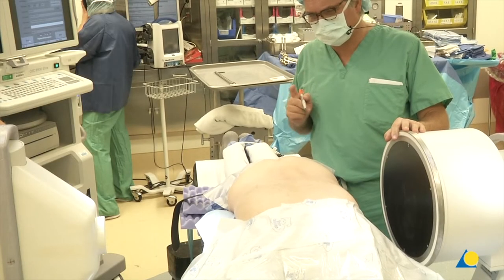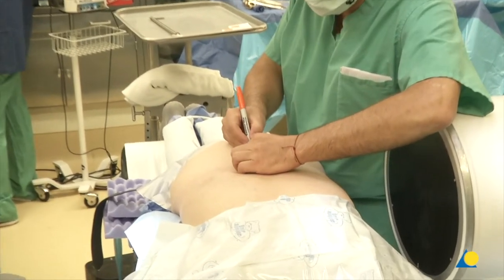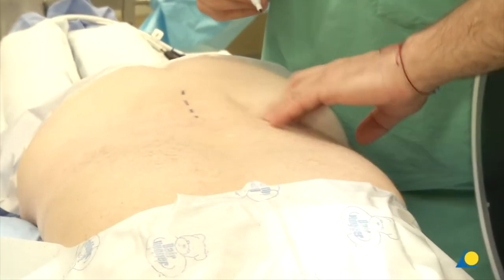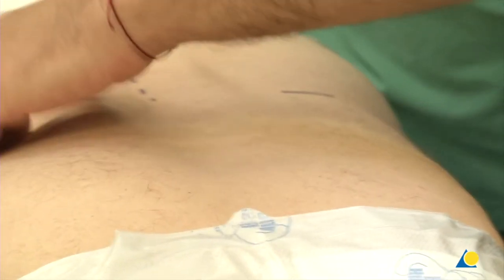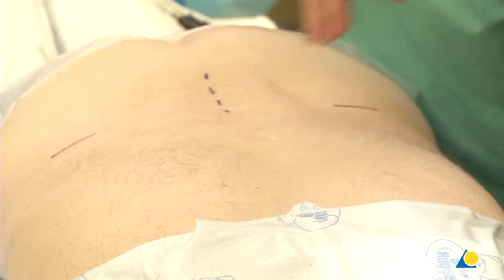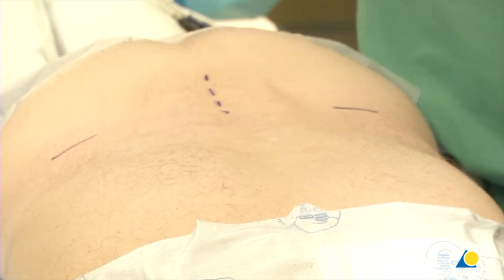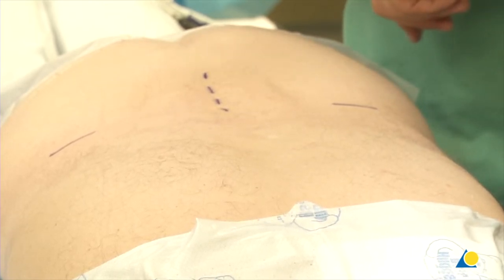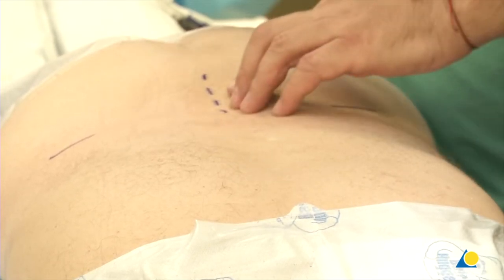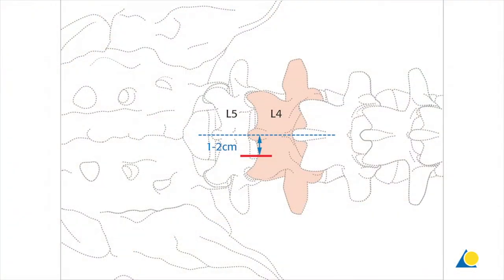We're doing a right-sided L4-5 laminectomy. We always feel for the midline first and mark it. I like to mark the iliac crest as a rough reference of where we're going to be. For an L4-5 laminectomy where it doesn't matter clinically from which side we go in, as a right-handed surgeon I prefer a right-sided approach. We'll make the incision about a centimeter to a centimeter and a half to the right.